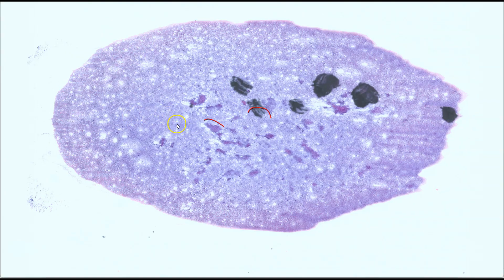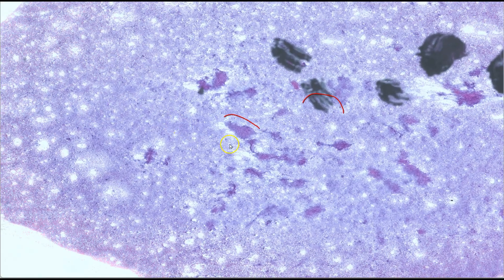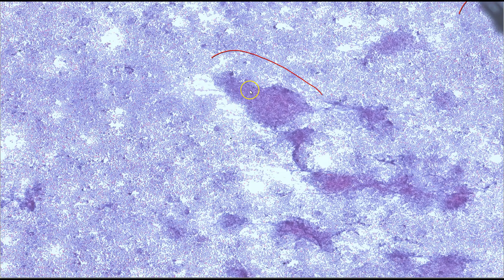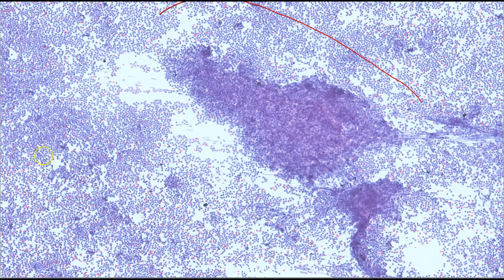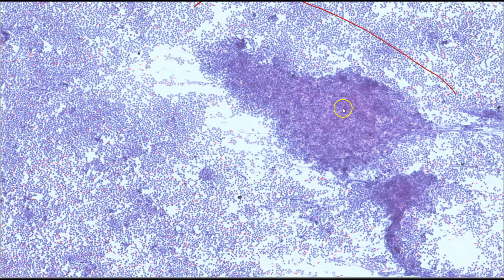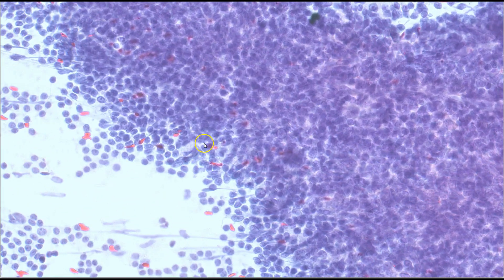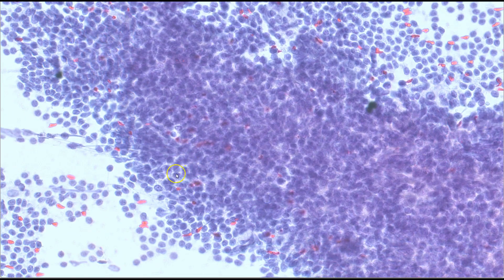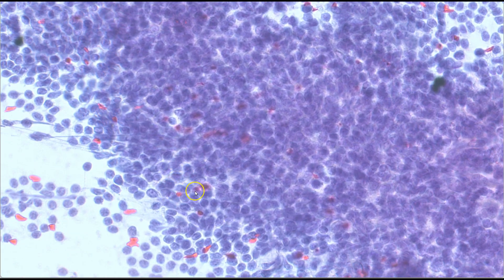This is the corresponding alcohol-fixed smear that was stained with the Papanicolaou stain. Again, we can see dispersed lymphocytes and these tissue fragments which, on closer inspection, are very clearly lymphoid in nature. The edges are relatively frayed and loose, and the cells are the same size and appearance as the lymphoid cells in the background.